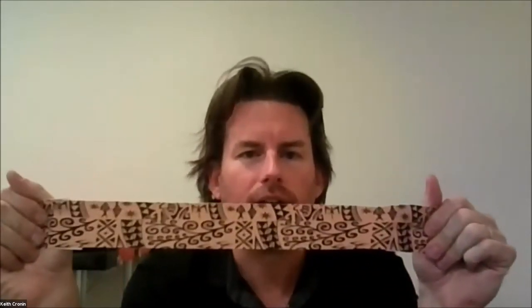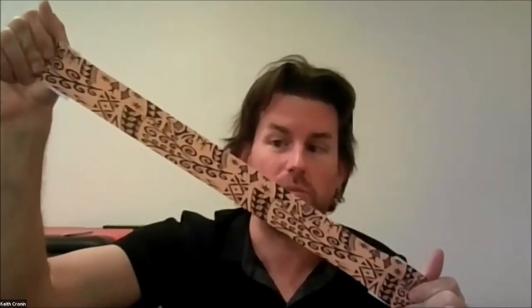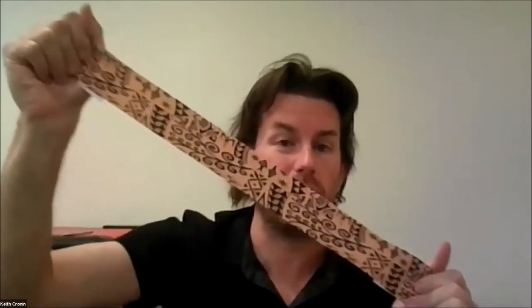And that's it. People ask, why do you only put that much stretch? It's because as the body part moves, it's going to stretch more. If you started with 60% stretch, you would go to 100 plus and you would rip their skin off. If you start at 10 to 20%, it will get into the ideal, which is somewhere around 50 or 60% stretch when they get through the whole motion. Then the skin can tolerate that amount of anchors and recoil, and it gives you the most therapeutic effect. So you put the tape on, take up the slack, go 10, 20% more, and then lay it down with those big anchors.